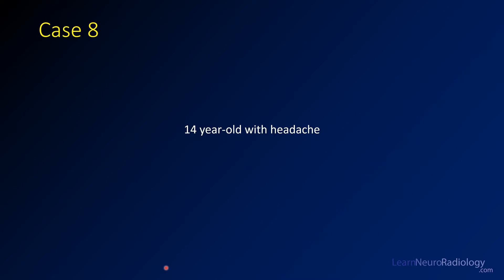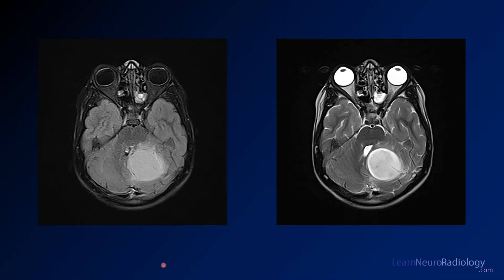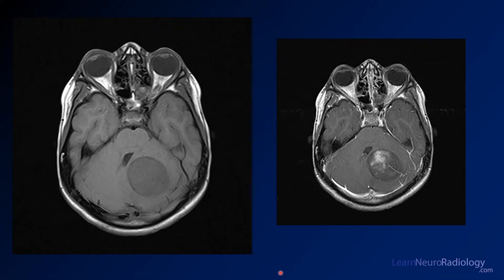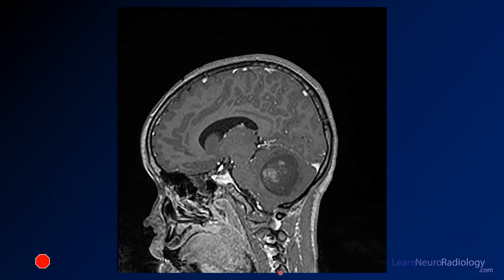Case 8 is a 14-year-old with headache. Here you have some images from an MR of the brain through the posterior fossa. There's a FLAIR on the left and a T2 on the right. Here you have pre and post contrast images. Here's a final sagittal post contrast image.